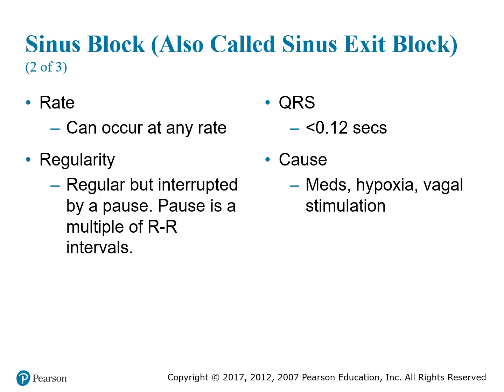With a sinus block, the rate can be any rate, it just depends on what's going on with it. It will be regular up until the interruption, and then at the interruption it will be paused. The pause is a multiple of R-to-R intervals, right? So the pause lasts longer than what one beat should be.